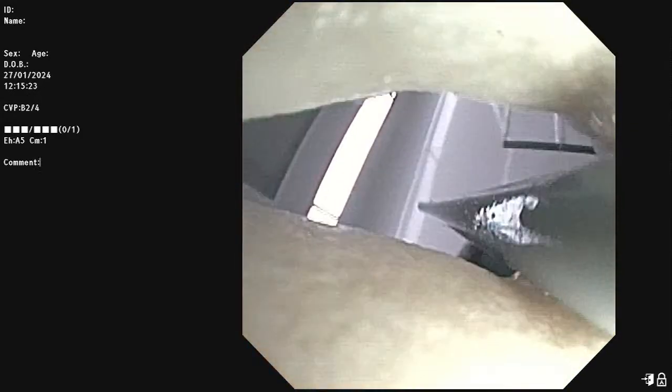Give it time. Give it time. It'll be almost 4.5 seconds. Oh, it's out. Okay. We can watch the end of the probe. That's when you can maybe try 6. Yeah, we can do about 6. That's okay. Good.